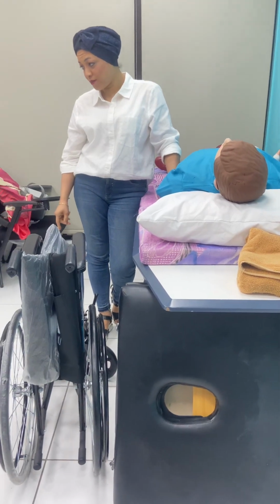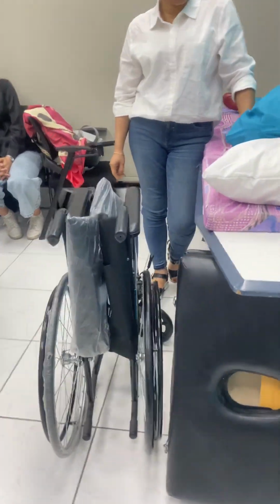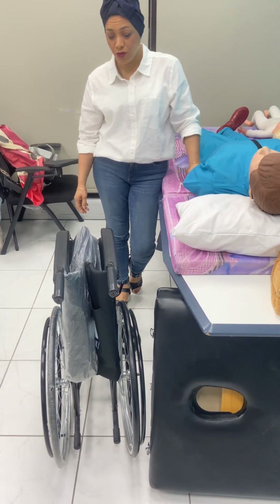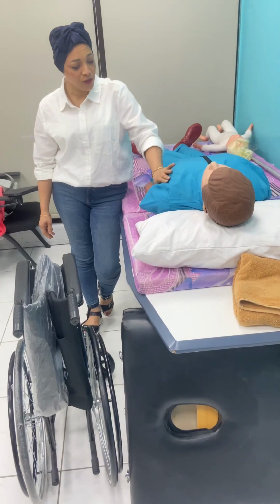Patient from bed to chair. Okay, and we start from the beginning actually. I have to come introduce myself to the patient. Hi, Mr. Ibrahim, how are you today?